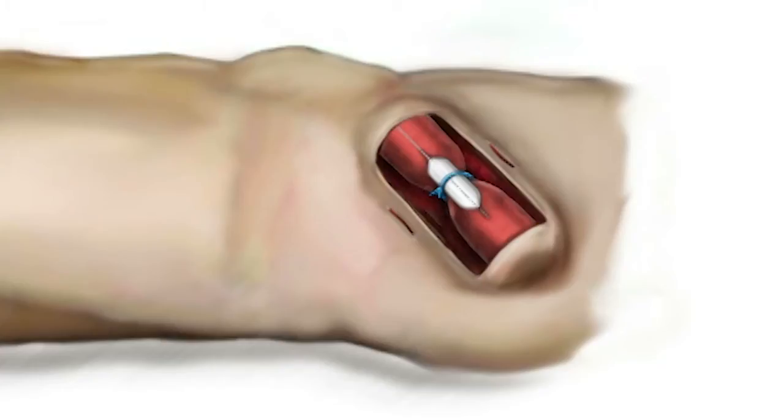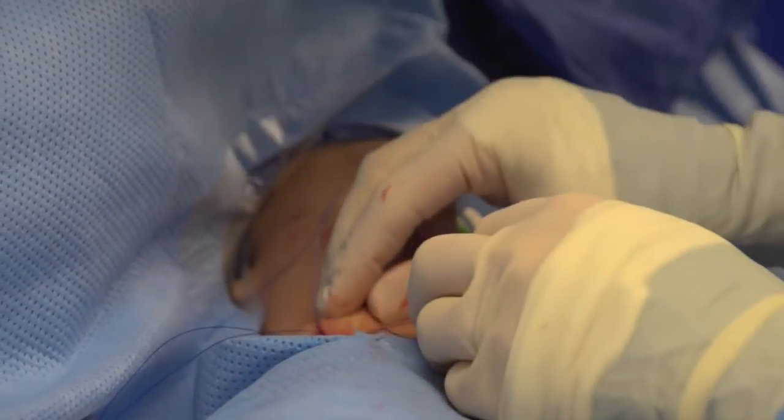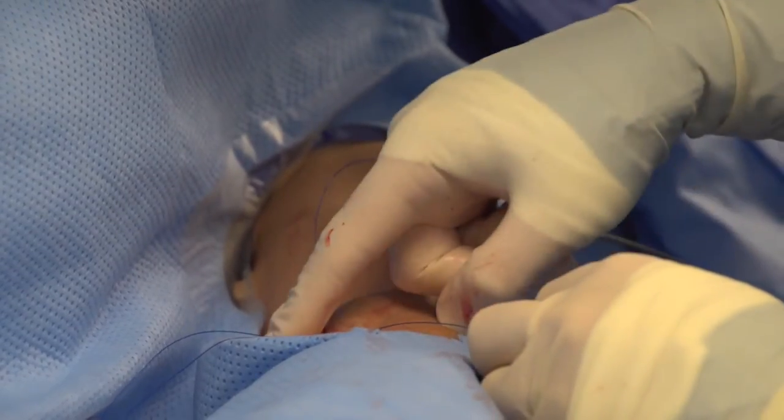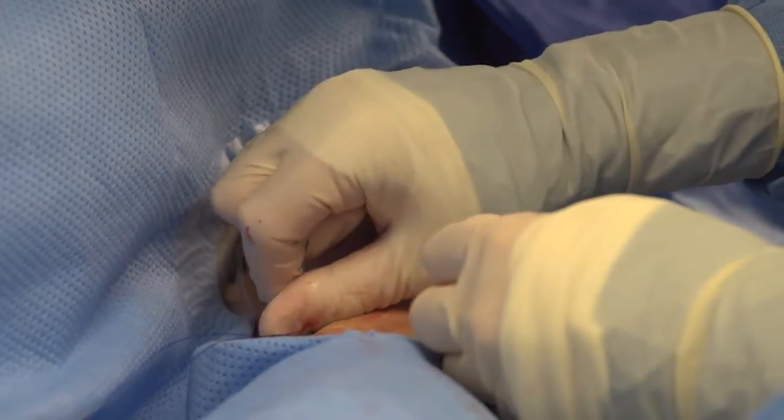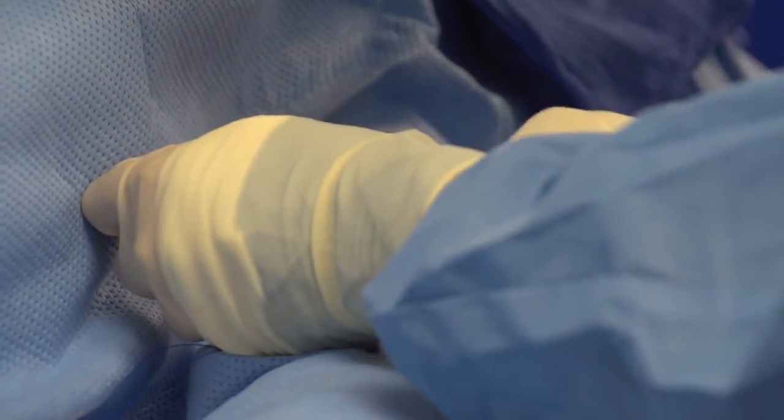That's where the angioplasty balloon comes in — we use it as a sizing dowel. We position the balloon across the area where we want to perform the banding, and when the balloon is fully inflated we tie our surgical suture down around it, giving a perfectly sized intraluminal diameter every time. I use a 2-0 Prolene suture because it has stretch, so you can make a 3 mm band for steal syndrome or a 4 mm band for high-flow access, and modify either by using a slightly larger balloon.